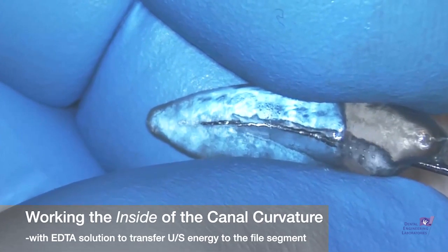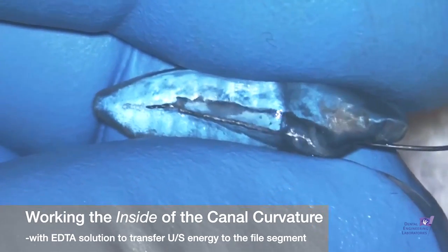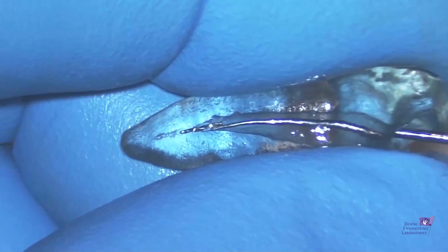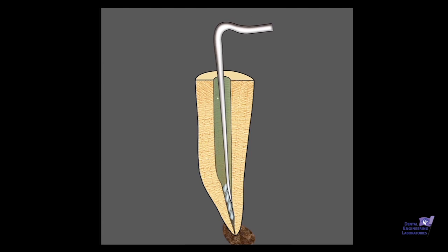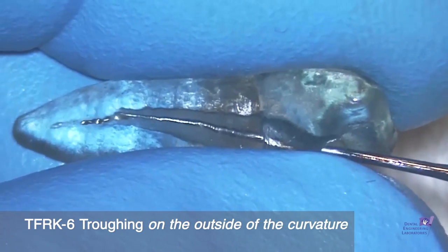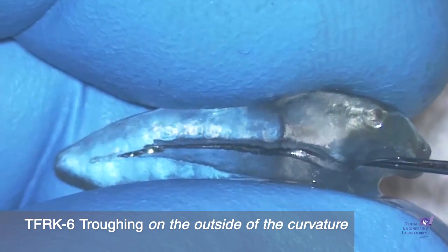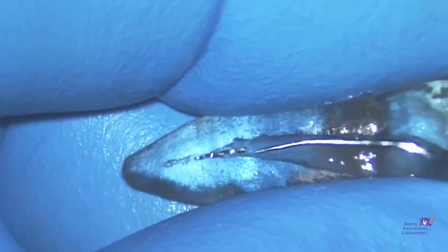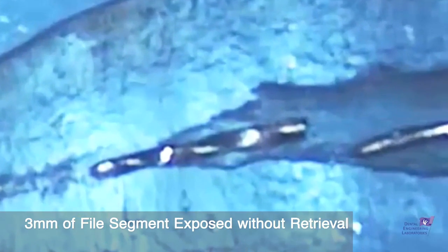That's one of the critical things that Dr. Tarauchi has identified about the necessities of removing a separated instrument: besides working on the inside of the curvature, another important thing to get this thing to vibrate out is to use the ultrasonic spear tip in the presence of ultra EDTA solution. It doesn't look like it's going to come out yet, so we use the six o'clock spoon — facing towards the handle — to trough a little bit on the outside since we already have the inside taken care of. Back with the spear on the inside of the curve, giving it another try again in the presence of EDTA solution, and the darn thing isn't coming out.